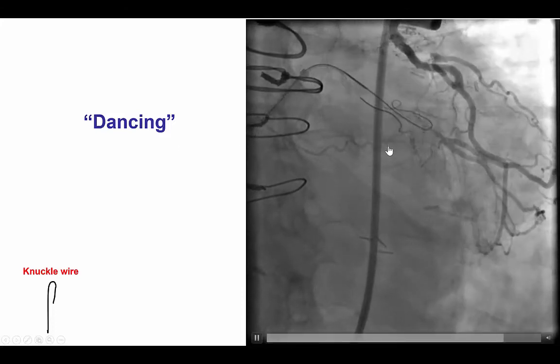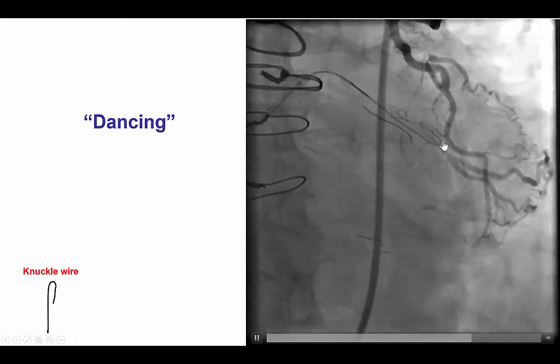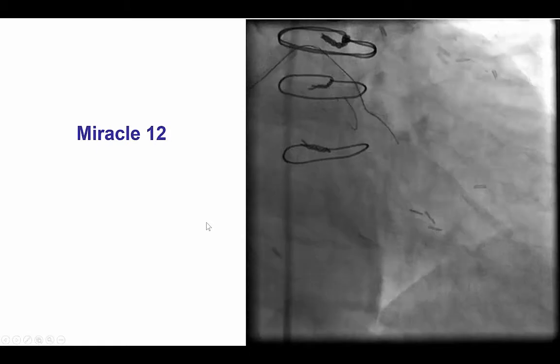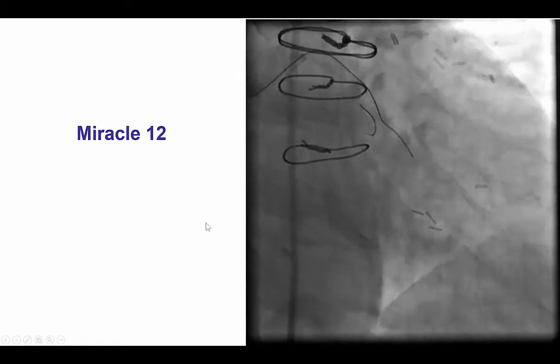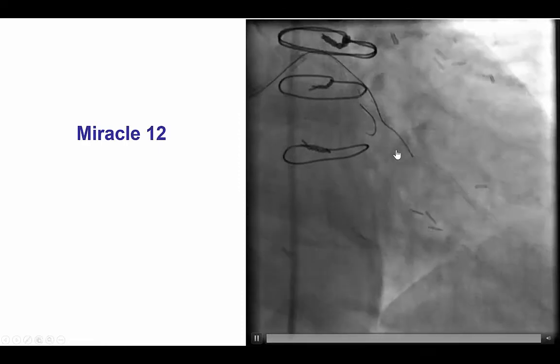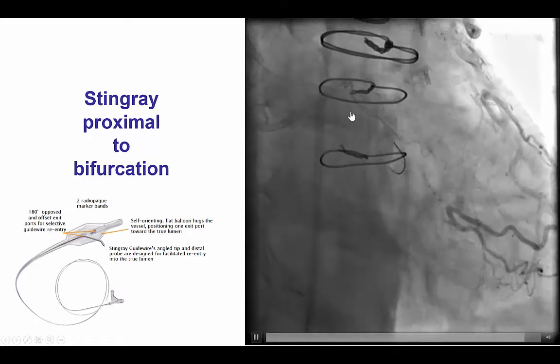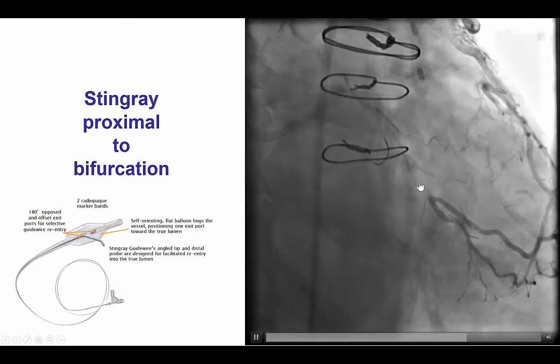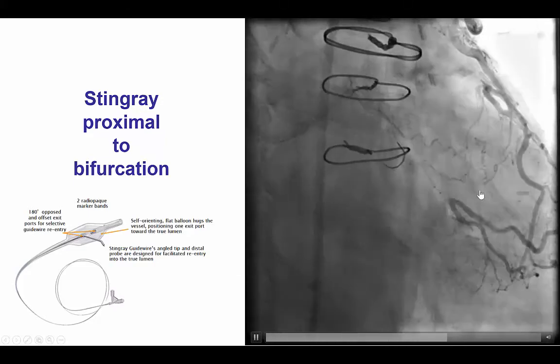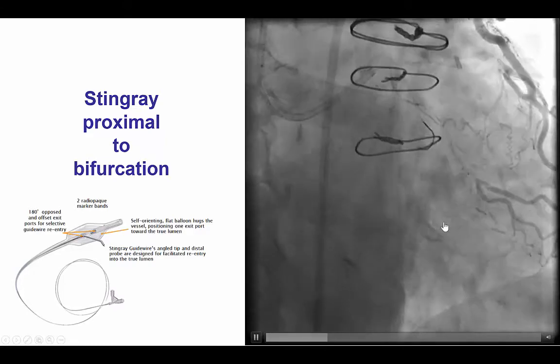By doing a contralateral injection, we now see very nicely that the knuckle is moving in sync with the distal vessel. This is what we call 'dancing,' which is a very good sign because it means we are in the same planes — subintimal given the loop, but in the same planes. Therefore, the next step is to try to re-enter using the Stingray guide wire. To deliver it, we exchanged for a stiffer Miracle 12 guide wire that provides a little better support, and then we were able to deliver the Stingray balloon without much difficulty, stopping it immediately proximal to the bifurcation, given that both branches of that large second OM appear to be fairly large.